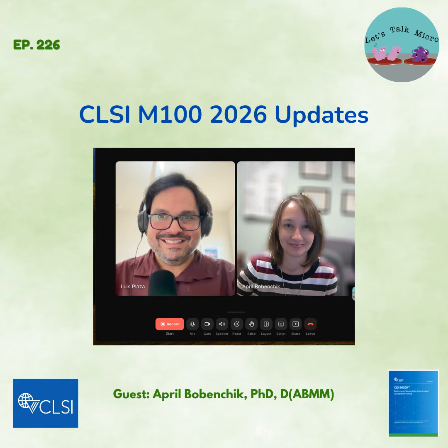Same thing, definitely go through your QC. If you're doing disk diffusion, look at the disk diffusion QC ranges. You want to look for any updates there, any bolded highlights. Make sure those are all up to date because that's most important. You want to make sure your QC is within range. And for any questions that come along throughout the year, like if your physicians come to you and say, "Oh, I want to bring on this new drug, aztreonam," then you have the breakpoints and the ability to bring it on if needed. So, yeah, definitely do that.